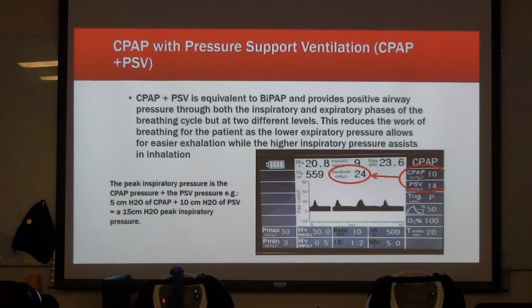With CPAP, you can somewhat talk when they're on that mask and hear them. When they're on CPAP pressure support, every time they say something, it gives them another breath. And then they're freaking out, and you're trying to calm them down. So it's going to be more yes and no answers when you're asking them questions, and say, don't talk, because it'll freak them out.